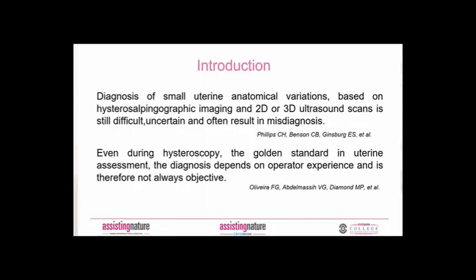Diagnosis of small uterine anatomical variations based on hysterosalpingographic imaging and 2D or 3D ultrasound scans is still difficult, uncertain, and often results in misdiagnosis. Even during hysteroscopy, the gold standard in uterine assessment, the diagnosis depends on operator experience and is therefore not always objective.